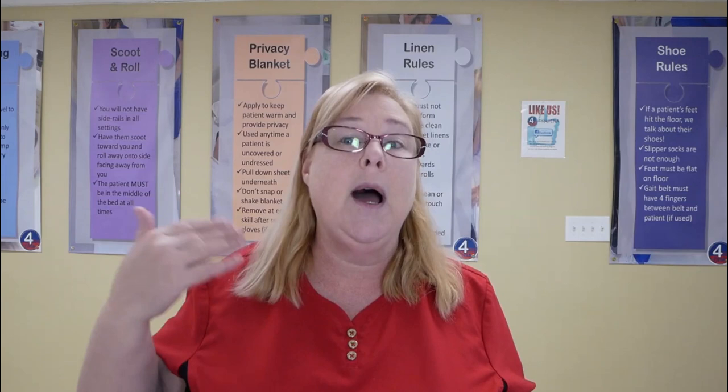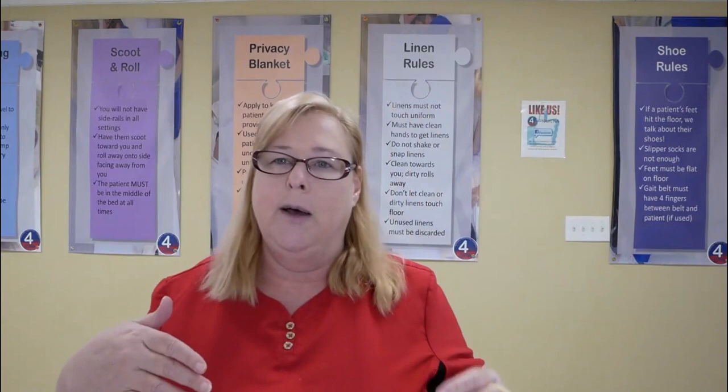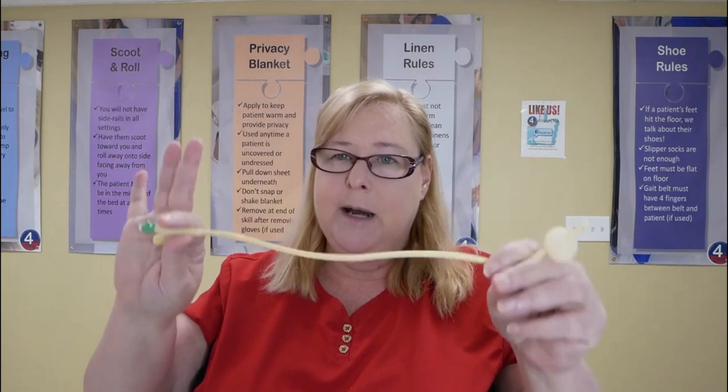Now, if I have a patient whose catheter got pulled out and you put this whole thing in a bag and I come along and I see the whole thing, right? The balloon is still inflated. The tip is still there. It's all intact. That is not a bad problem. I can deal with that. But if you pull this catheter out, put it in a bag, and this balloon is broken, and a piece of it is missing, or the tip of the catheter is not there, that is a much bigger problem because that means that a part of the catheter was left behind in the bladder. We have a foreign object in the bladder. So we have to address that. That's a much bigger problem.